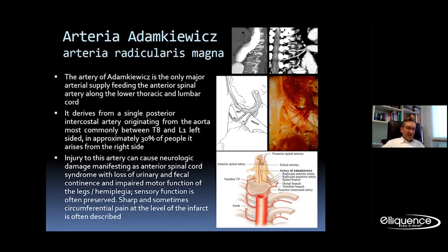We did everything to figure out why this was a hemiplegia, and at the end we learned that we affected the Adamkiewicz artery during the surgery, and this reduced blood supply led to some neurological symptoms, as you can see here. So always be careful when you do this. There's a high variety of this artery, but when you see it, keep away.